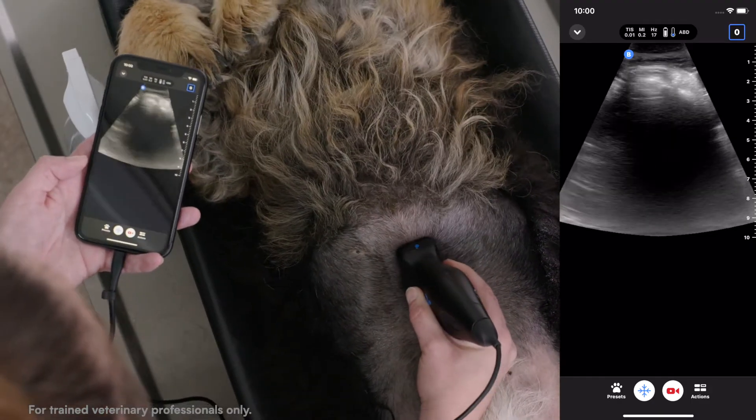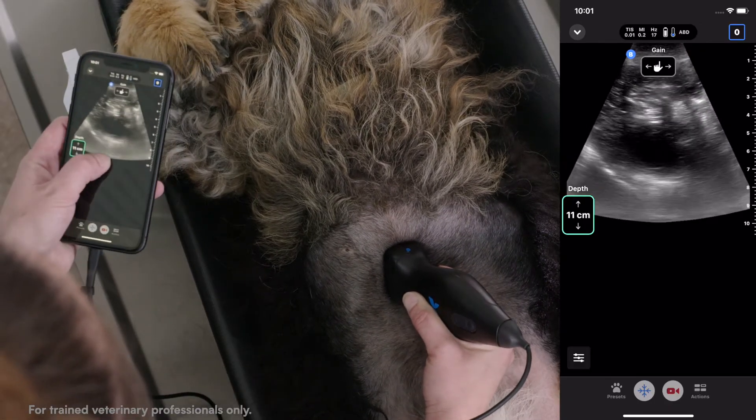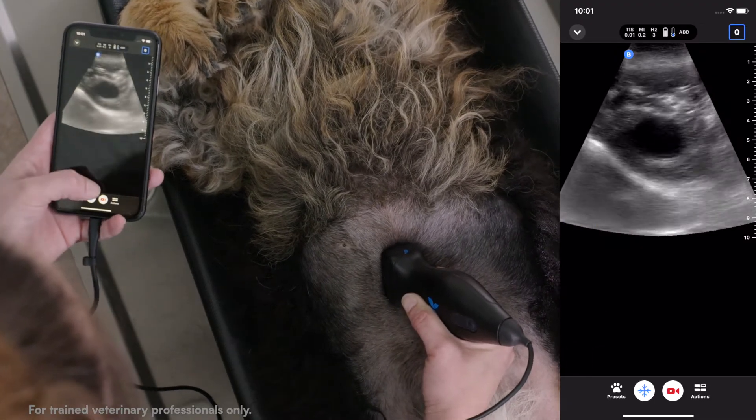Once we place our probe, we'll look for that dorsal diaphragm — that hyperechoic line — and adjust our depth by moving our finger up and down to the level of that dorsal diaphragm.